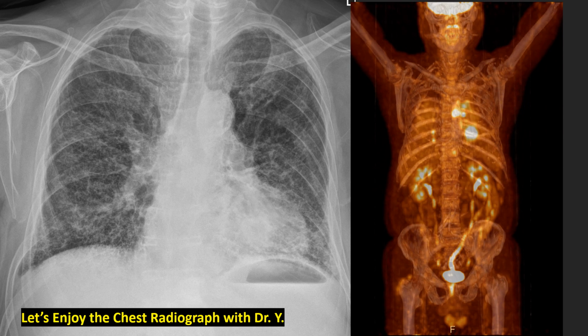This MIP PET CT scan image shows a left lower lobe mass with hot uptake here, and many hot uptakes in the left side lymph nodes and subcarinal lymph node, and on the right side maybe bone or lymph node, and spine metastasis. Yes, it is far more advanced than the radiograph and CT scan.